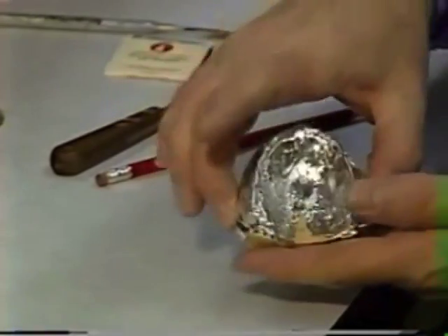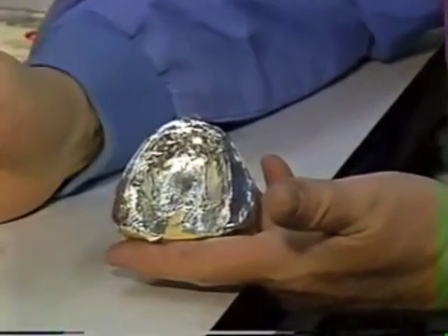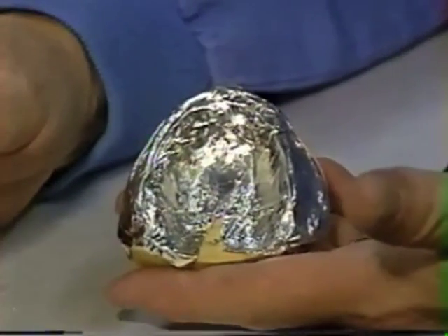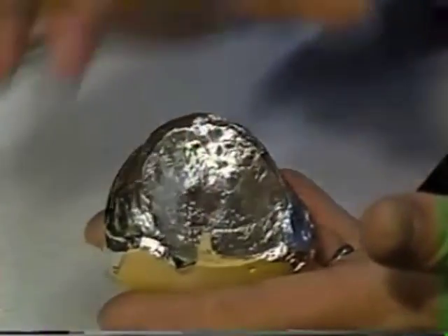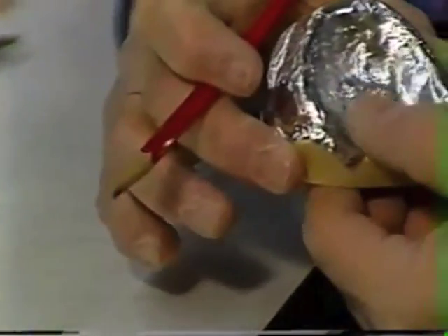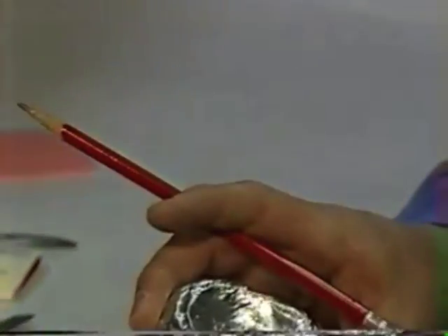But about like so, and you can see there's a little spot in here that we don't have tin foil over, but that's not going to bother us in one way or the other. Okay, if that were wax in that area and we were trying to protect it from the wax, then we would want to cover that. But since it isn't wax, we can leave that one alone. Okay, now that one is ready at this point.